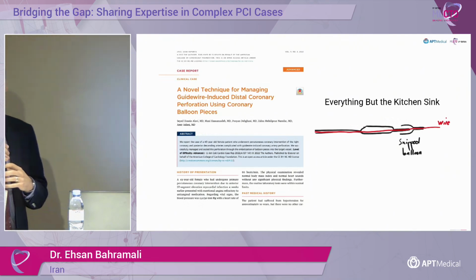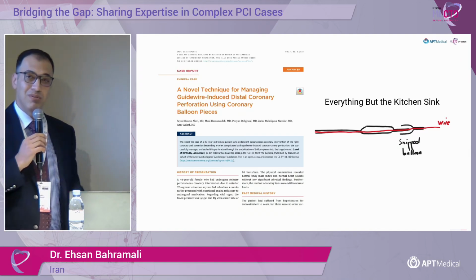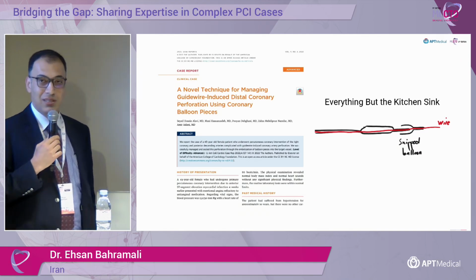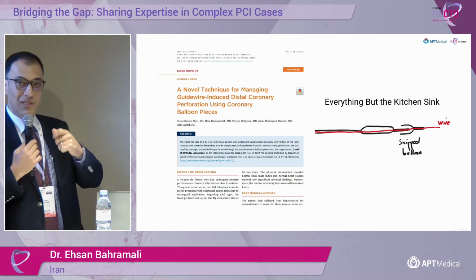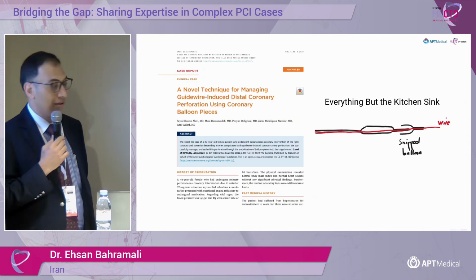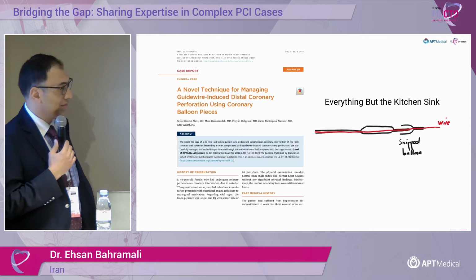For all the cases, we could manage to stop the bleeding by this method, but it depends on the size of the vessel you are treating, and the importance of it, because you are occluding the vessel totally. Sometimes coils are better options, sometimes fat is a better option, but it's a fast option to stop bleeding.